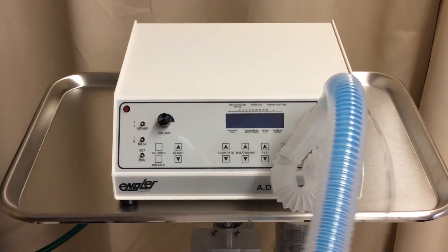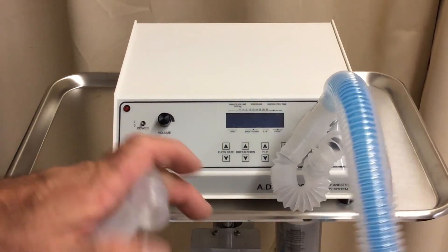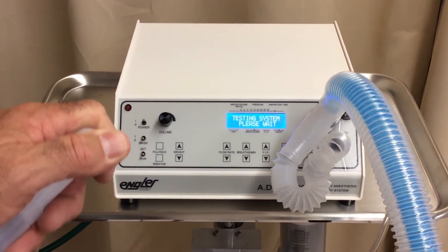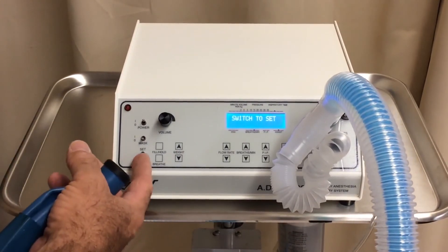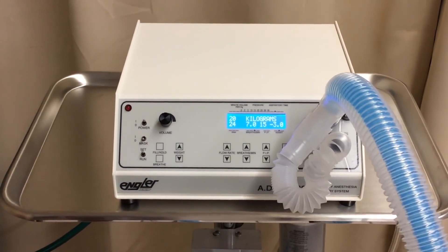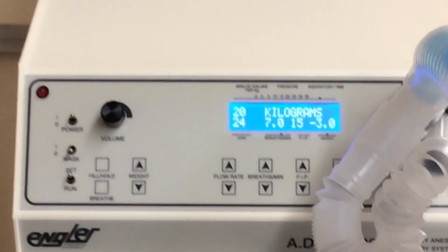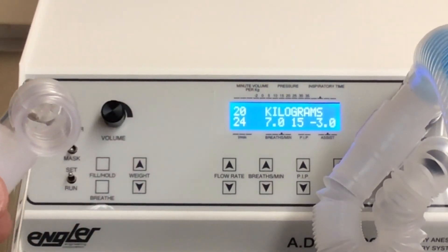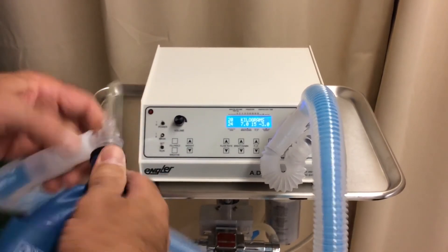We have just done everything we need to do to set up the ADS-2000. You've seen us connect all of the connections in the back and all the connections in the front. Now, when you first turn the machine on, it goes to a self-diagnostic test. You cover your finger over the breathing circuit and turn it on. It is now conducting a self-test. Once it approves that — it's telling us we have to switch our button to set. It automatically defaults to 20 kilograms; that's our starting point every time we turn the machine on. Now we connect our intubated patient — in this case, our intubated patient is a test lung.